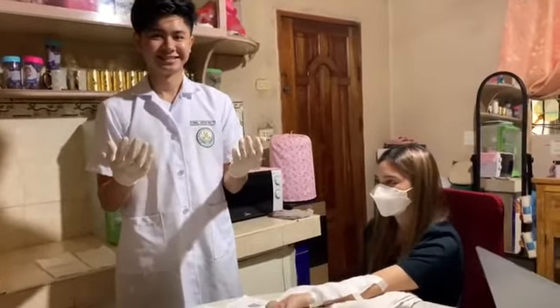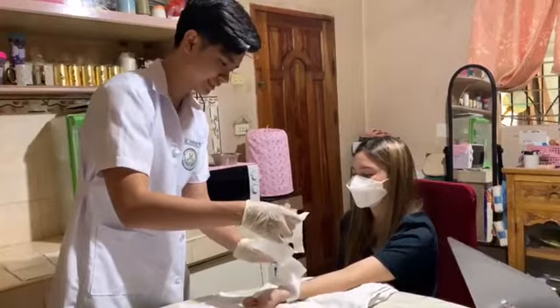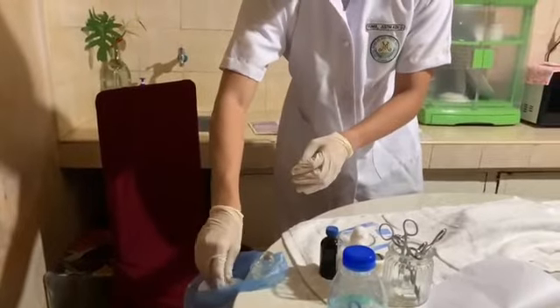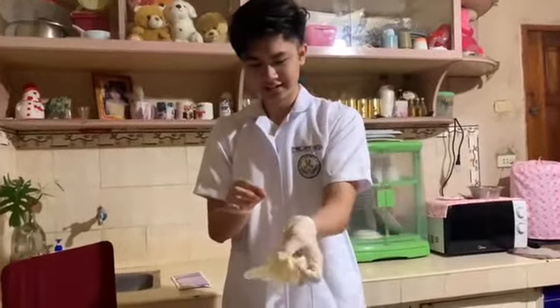After you remove the soiled dressing carefully, discard the dressing in the plastic bag. Then, pull off the glove inside out and drop it in the bag. Then, wash your hands after you have successfully removed the gloves.